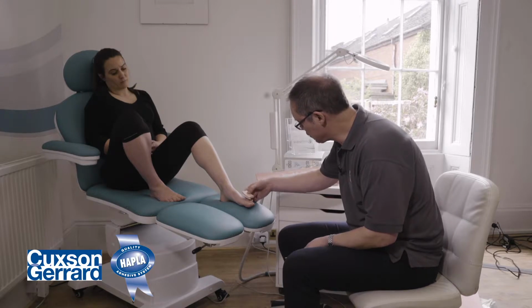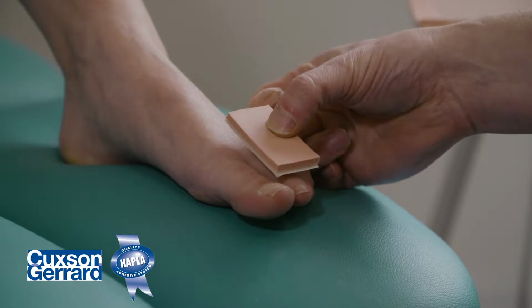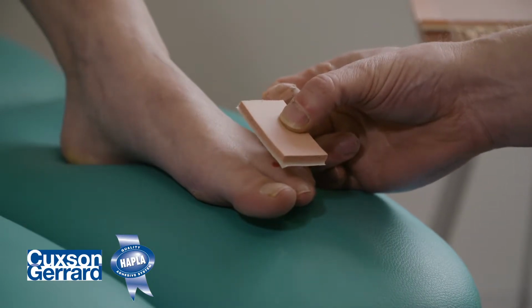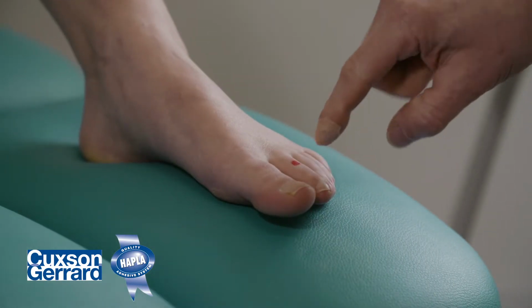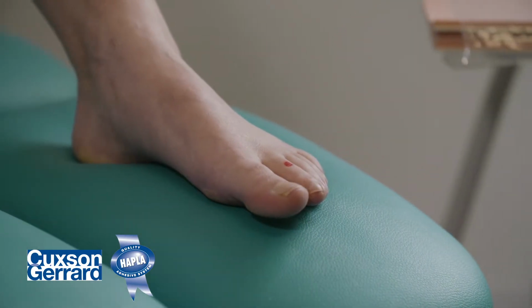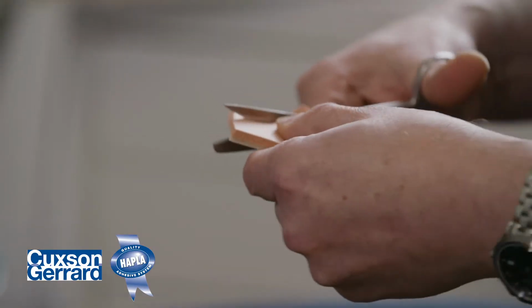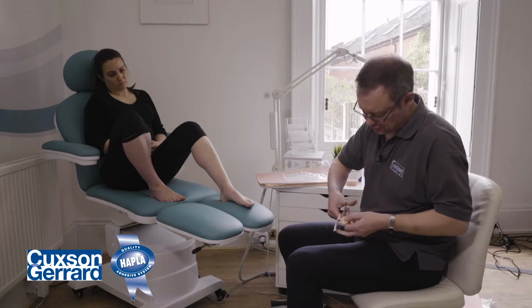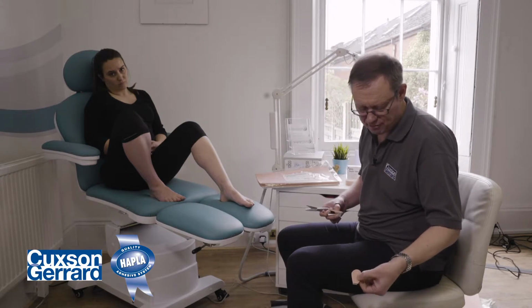So this is quite large, but this pad is going to be shaped into a teardrop shape or an egg shape, where the convexity at one end is larger than the convexity at the other. And it's just going to sit over the digit, obviously, but not over the nail plate. So cutting that shape out, we're left then with this sort of teardrop shape.